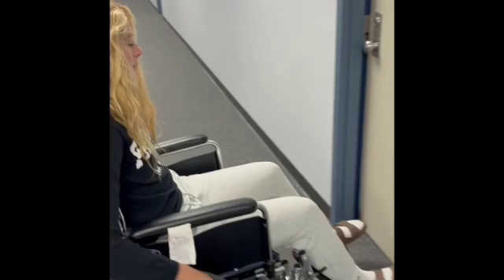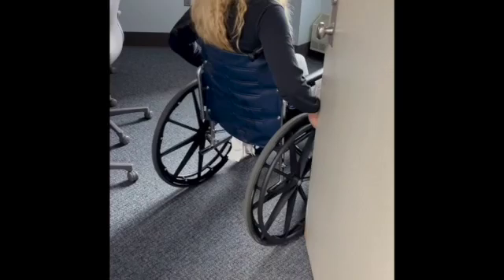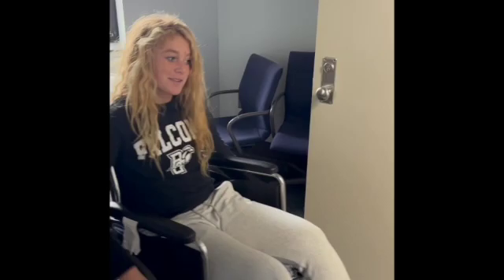To navigate a door independently, wheel as close to the door as possible, grab the knob, and wheel with one hand while pushing the door open. To exit, back up with one hand on the wheel while using the other to hold the door open, then mosey your way out.